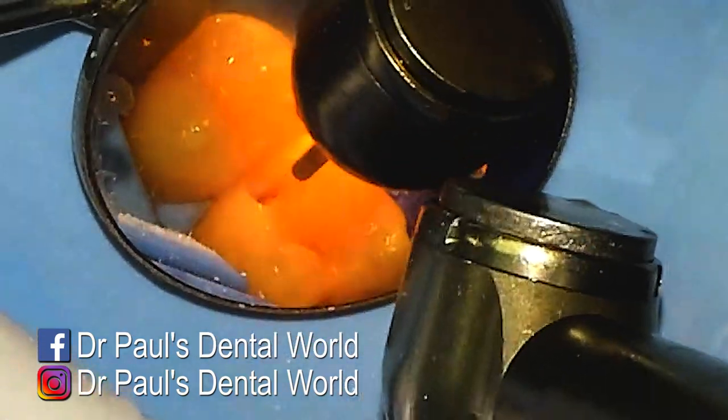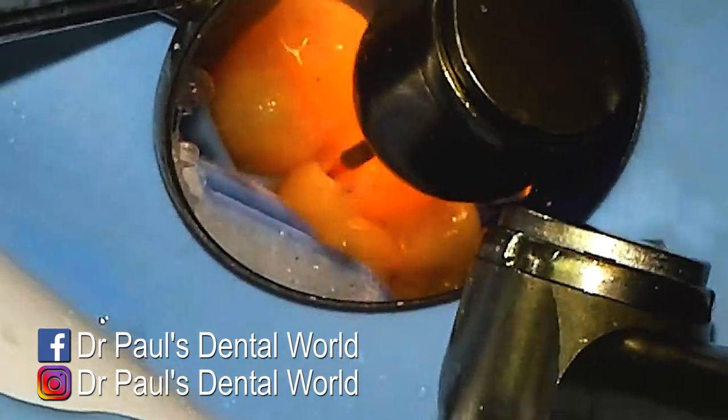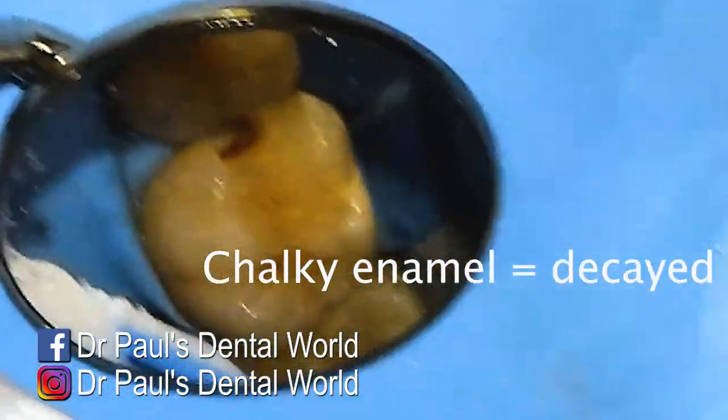Now that I know where the decay is, I can be a bit more aggressive when I remove it because I know exactly where it is. So I'll extend past it to make sure the enamel is clear.